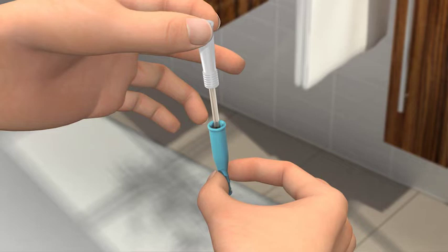Make sure that the catheter tip and surface does not touch anything before you enter it into the urethra. If it does, you must use a new catheter. Touching the sink or your clothes or skin, for example, will contaminate the catheter and can potentially cause infection.